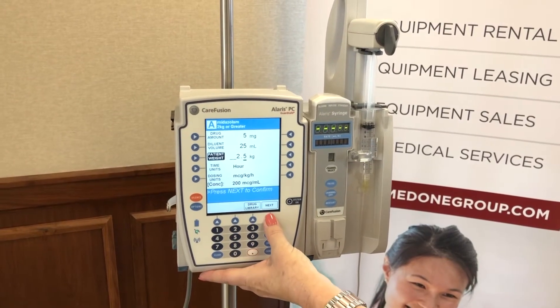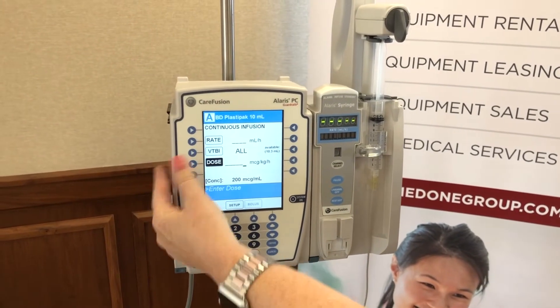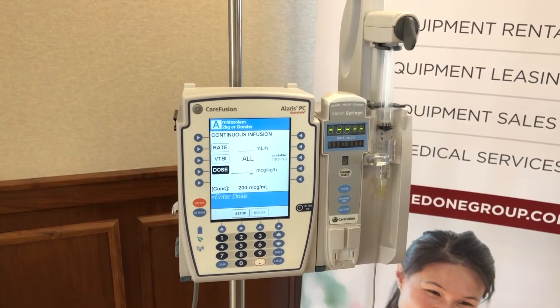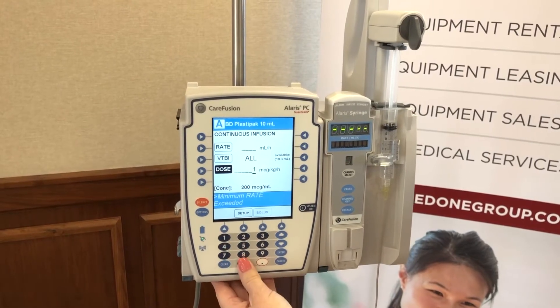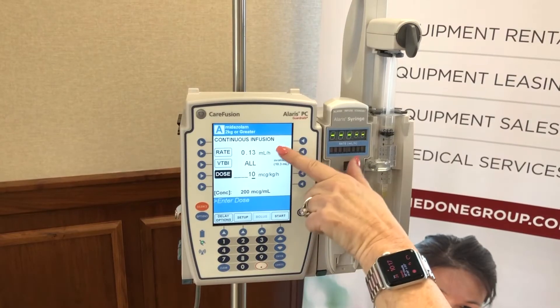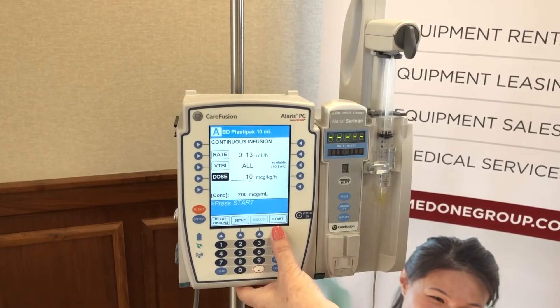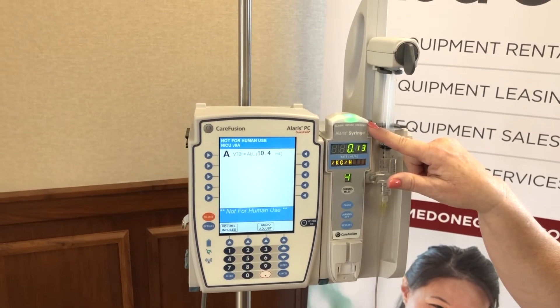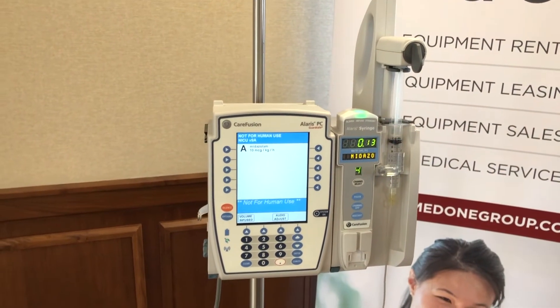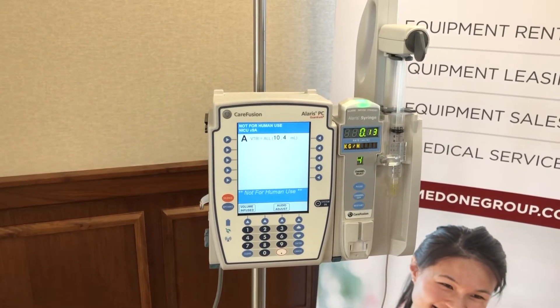Press the next button to confirm, then we're going to enter a dose — we highlight dose, leave the volume default to all, and put in a dose of 10 micrograms. It will calculate the rate because it's a rate/dose calculator. Then we press start. Again, the same green light meaning everything is good — the dose is listed below and the name and amount of the drug scroll through the marquee.